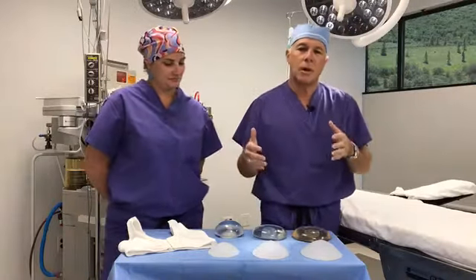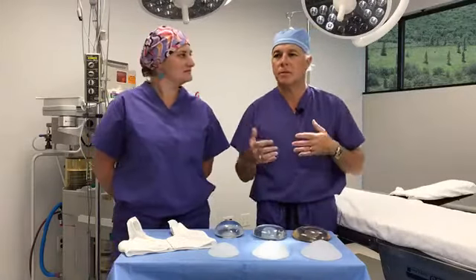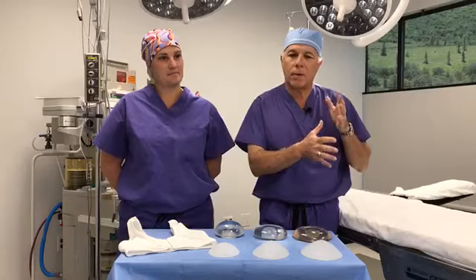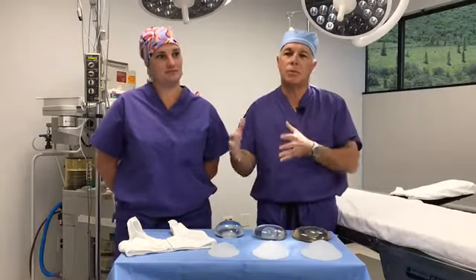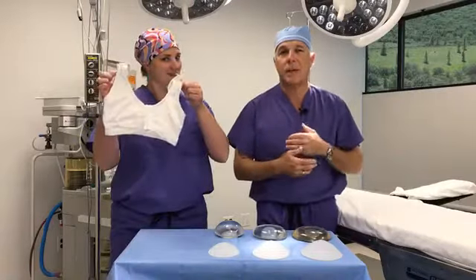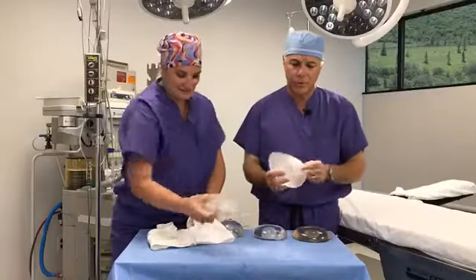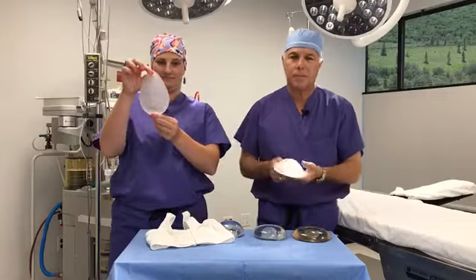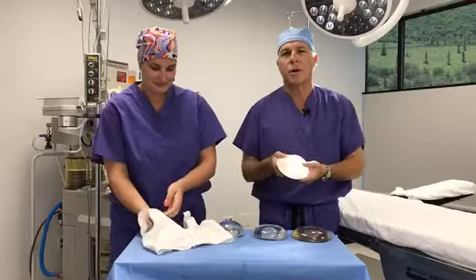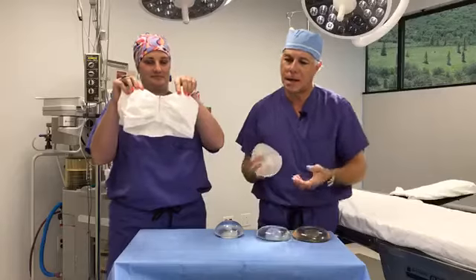So assuming that we're just talking about breast augmentation, which is a pure volume change, and we're not talking about lifting procedures, that's for another day, we usually have patients start out trying to help us figure out how we get from A, B, C, D to cubic centimeters. We have them try on sizers. Lindsay usually spends a lot of time with patients in the room trying on sizers, and these are not real implants, but they're designed by the company to mimic, ballpark, what that volume would look like, putting it in a bra and trying it on in the office, and how close that would get to a round implant inside the patient's anatomy.